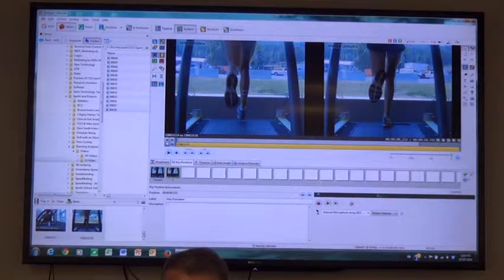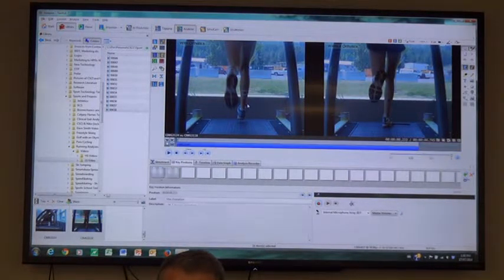So I would capture another key position and call this max pronation. And then I would list this 94.3. And then I would do the similar thing on the left side.